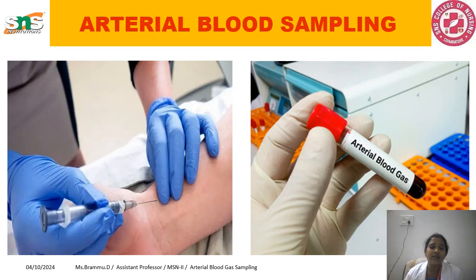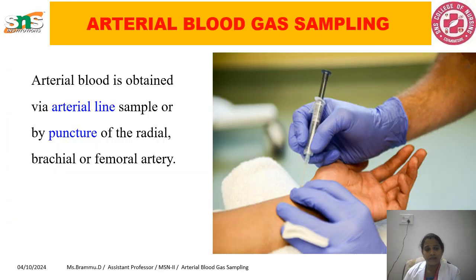We will also need certain requirements, such as a heparinized syringe before puncturing, and we will be doing certain tests before doing the arterial puncture. And how do we transport the ABG blood sample, what is its time limit, and during transportation what are the essential requirements, such as how you take the sample from the ICU or from the OT to the sampling area for analysis.